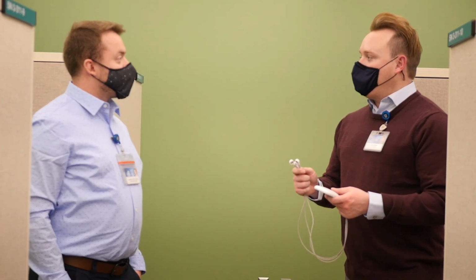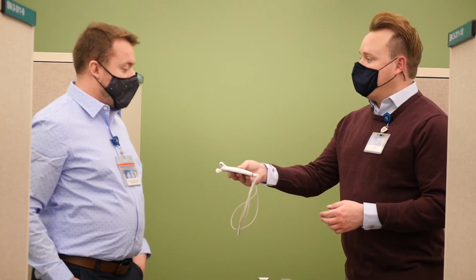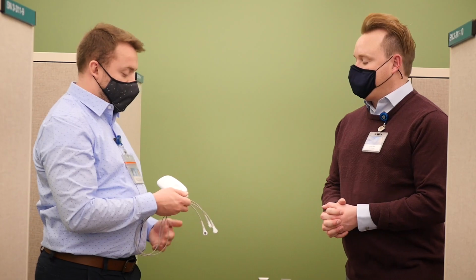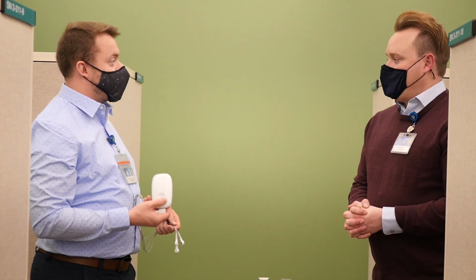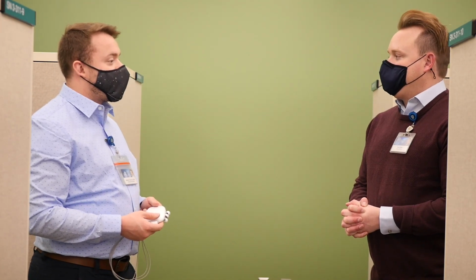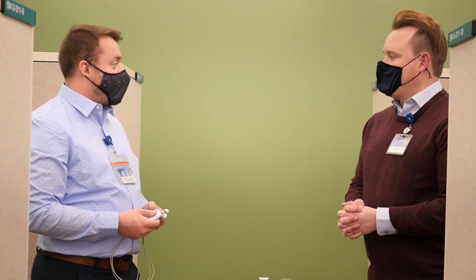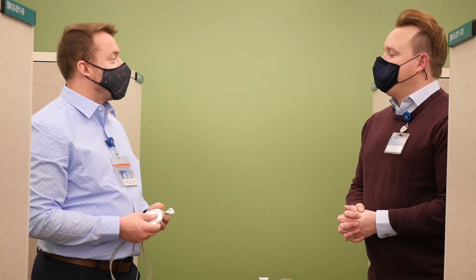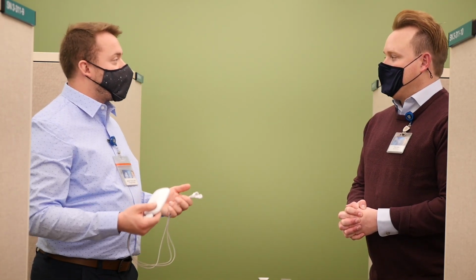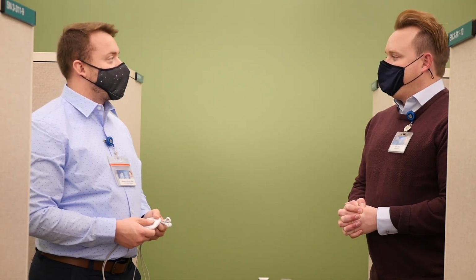So how often do people wear this? Is it 24/7? Is it only when they're doing strenuous activity? So this is a 24/7 thing. The only time I have them take this off is when they're swimming or when they're showering. So we can't submerge the device in water. But other than that, I expect them to try to wear it if possible. That includes things like exercising, going through their job, sleeping at night. As much as possible, I try to see what the heart's doing.